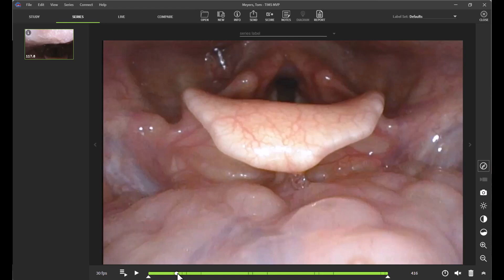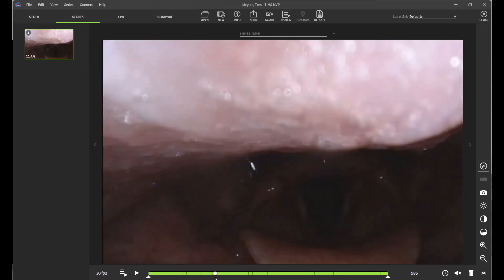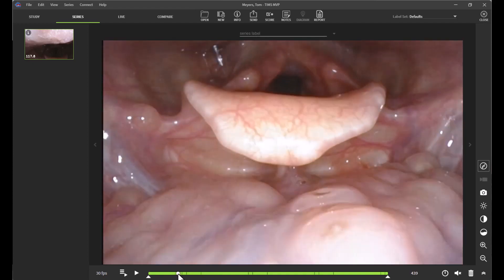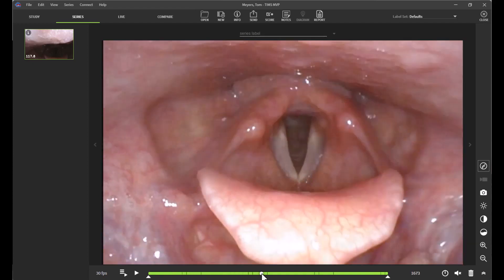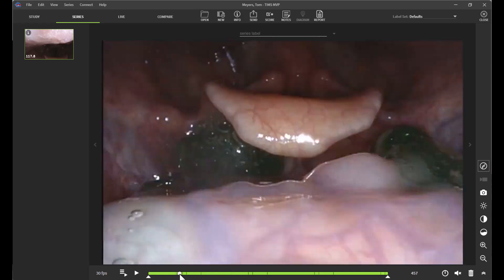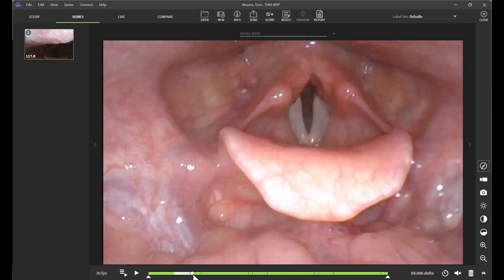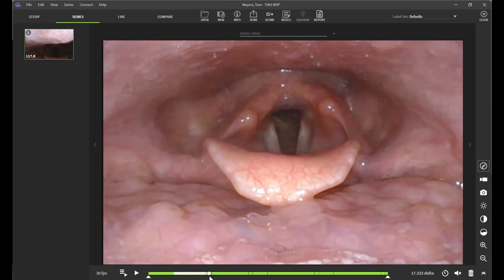So let's say that I want to create some shorter clips and really only isolate pertinent information. I can easily do so first by scrubbing through my video to assess what it is that I'm wanting to obtain, and then by creating sub clips. I'm going to right click here and start dragging my cursor as shown. You'll notice that I have a white overlay, and I can create this into a shorter sub clip by clicking on the camcorder icon here.